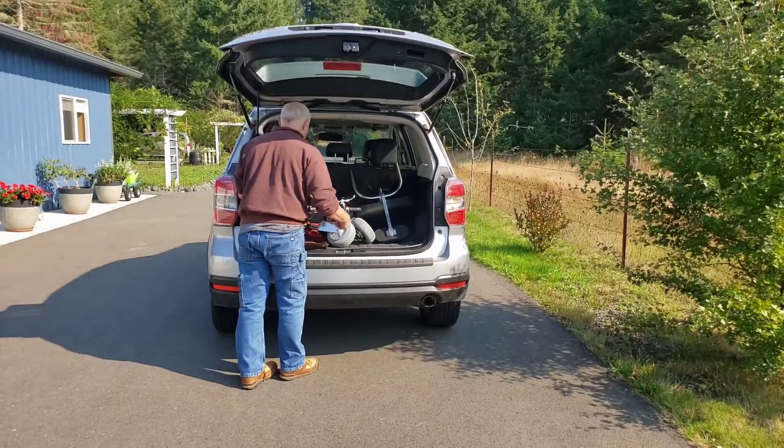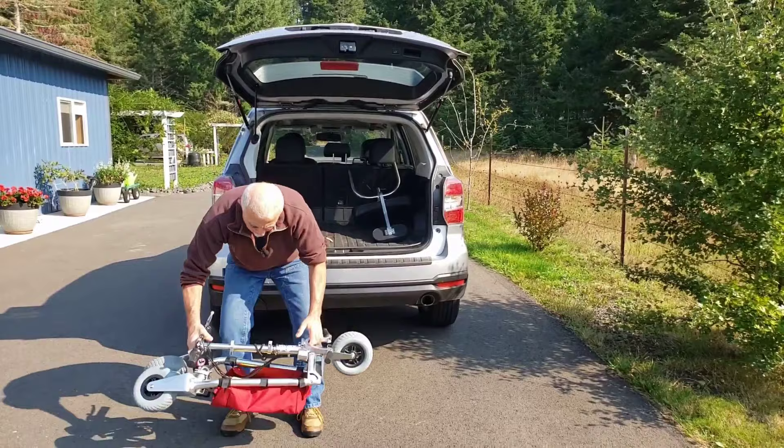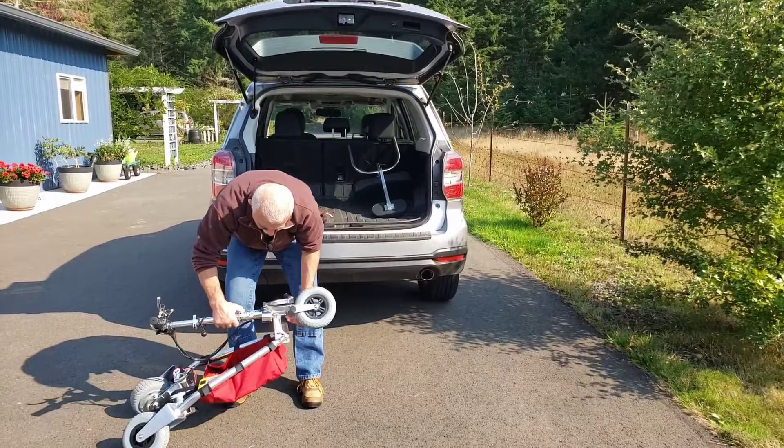Unloading is done in reverse order of loading. Stick your scooter in, set it down, prop it up. This is something that you'll get good at with practice.